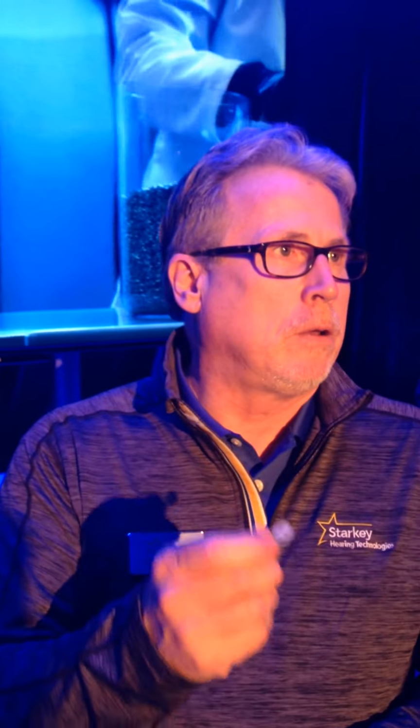Plastic part requirement will guide us towards what kind of plastic we're going to use. This is a spine. The spine and an ear hook, for example, have different requirements that the other may not. So we use 2 different kinds of plastic.